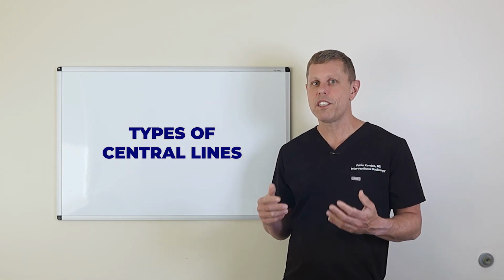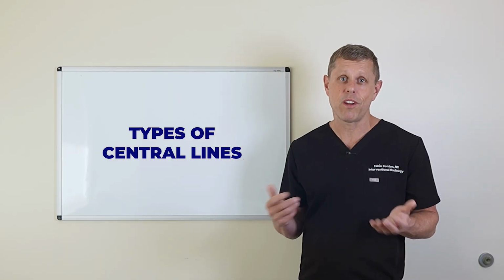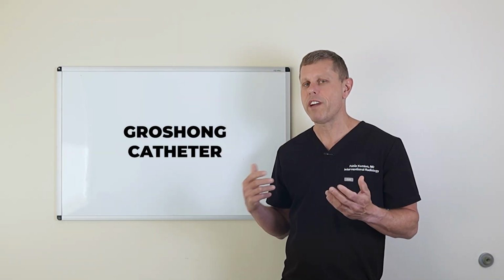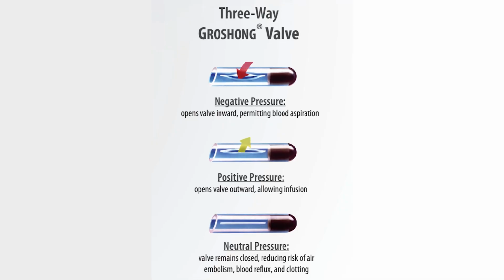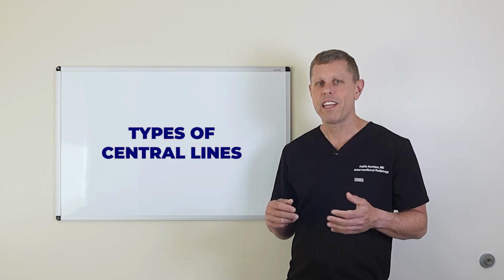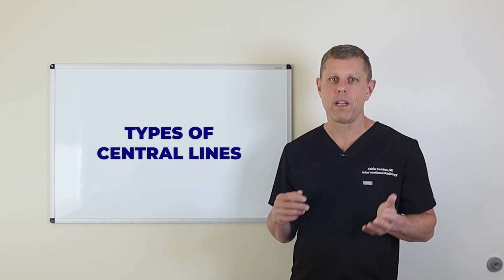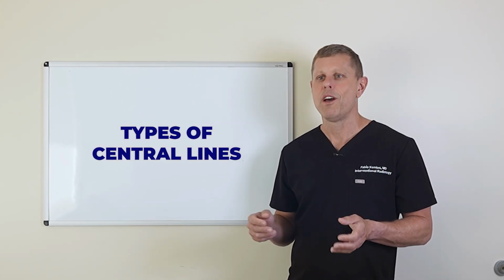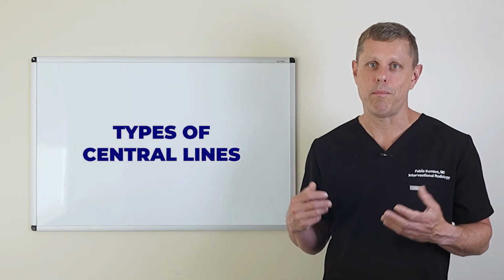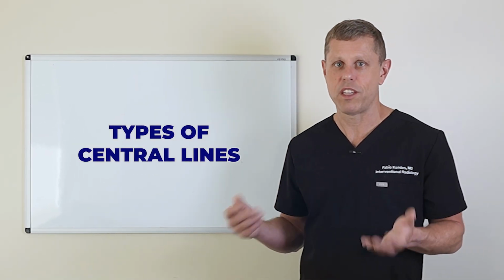And the other special type of tunneled central line that you may hear about is called a Groshong catheter. Now, they're very similar to a tunneled PICC line, but they have this special valve that reduces the need for daily flushing and theoretically lowers the risk of having a blood clot in the catheter. But I'm not sure that in practical terms they are better than having just a tunneled PICC line or a regular PICC line.